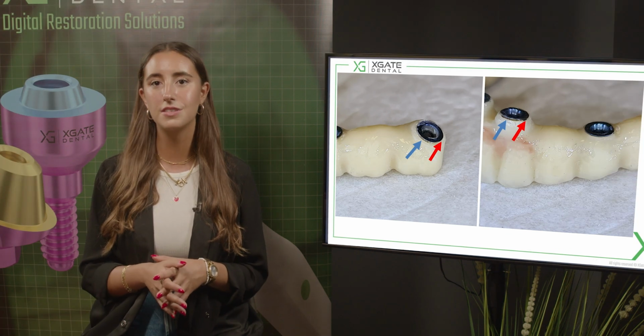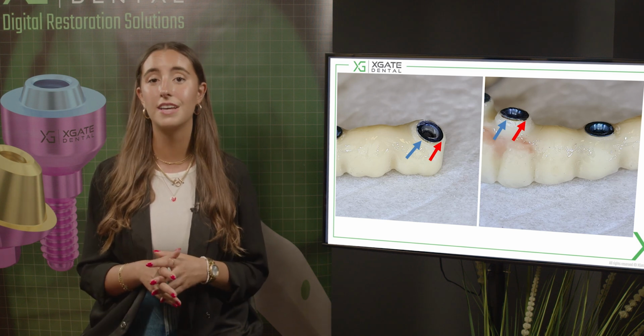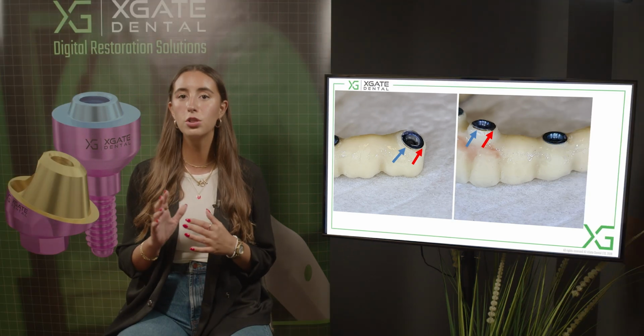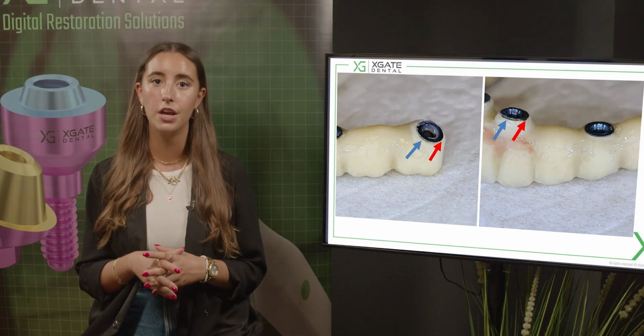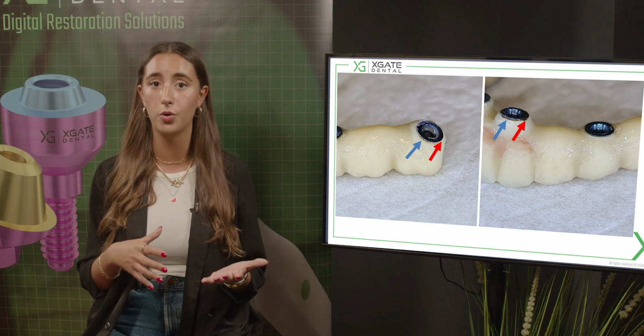You can see in the posterior part that the gap is not very small. In this case, you wanted to make a zirconia bridge, and then you attach the zirconia bridge to the multi-unit, and you probably will have a problem. It's not a large deviation because it's in the modification. It's like 0.1 or 0.2 millimeter. And all of these deviations are because of the cementation process.